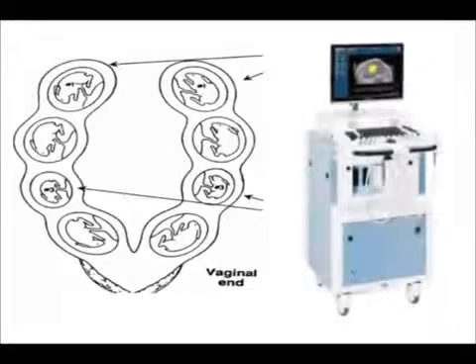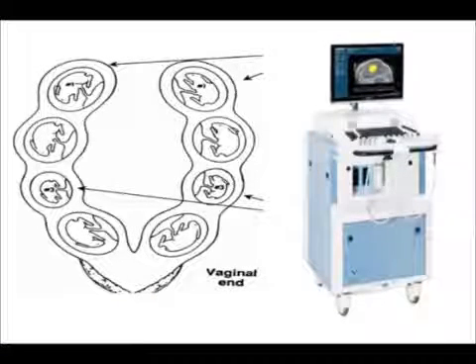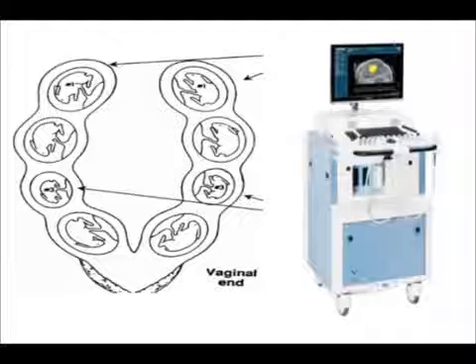Fetoplacental Doppler ultrasound and fetal echocardiography are carried out to obtain measurements of fetal hemodynamics and cardiac function and structure in IUGR and control fetuses. This method can help answer key questions in fetal medicine and adult cardiology, such as whether abnormal physiological pressures can lead to disproportionately profound changes in cardiac structure and function later in life.